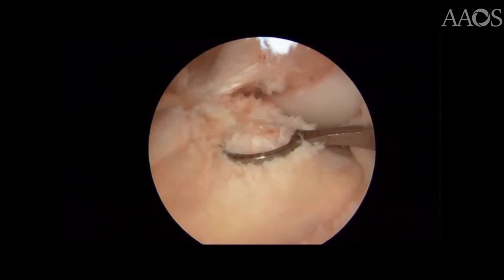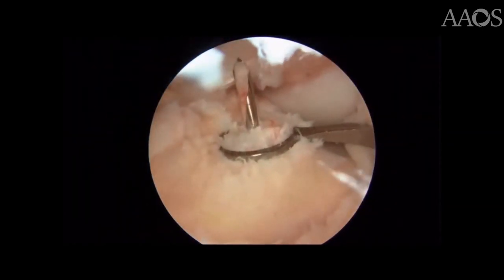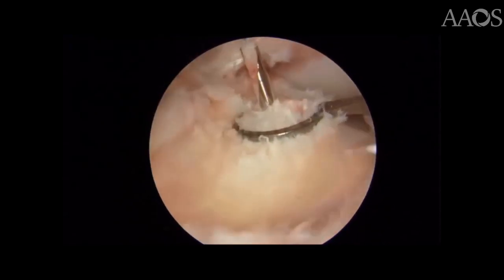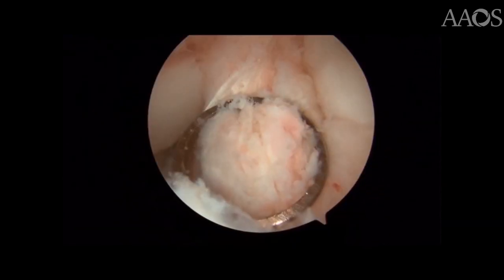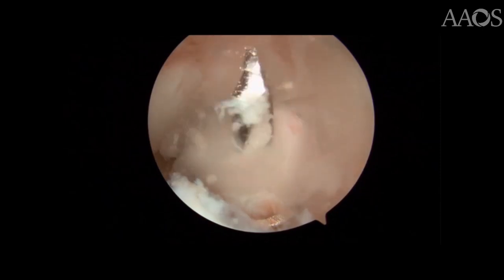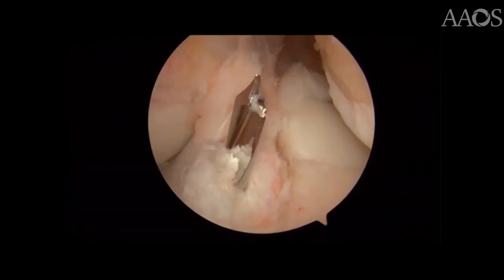A guide pin is placed in the center of the ACL tibial footprint using the tibial guide. Leaving a remnant tibial footprint allows for an accurate representation of the native ACL tibial attachment and also preserves proprioceptive fibers.